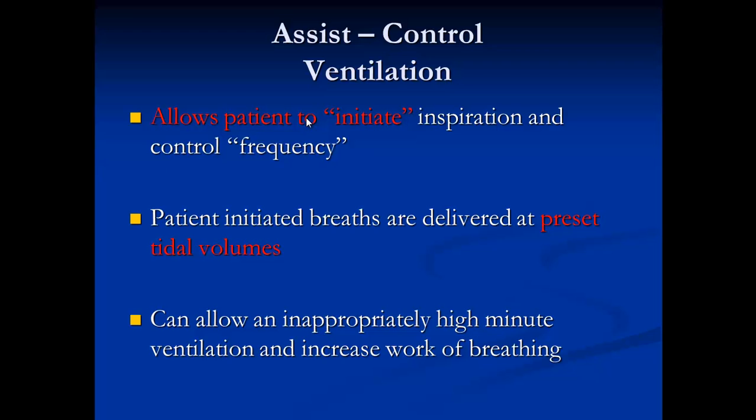A preset tidal volume or a preset pressure and inspiratory time is delivered at a preset minimum rate. The patient receives a minimum number of ventilatory breaths or backup rate synchronized to spontaneous effort, and the number of breaths can be increased beyond the preset rate with additional inspiratory efforts.